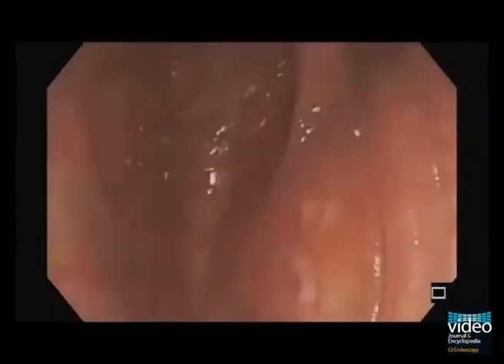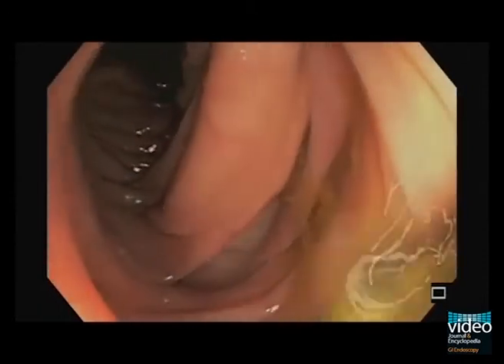Slow staccato in and out movement by withdrawing 3 to 5 centimeters and reinserting 2 to 3 centimeters is useful in the transverse colon and other poorly visualized areas. We advocate a 2-pass examination of all the flexures and the sigmoid colon.